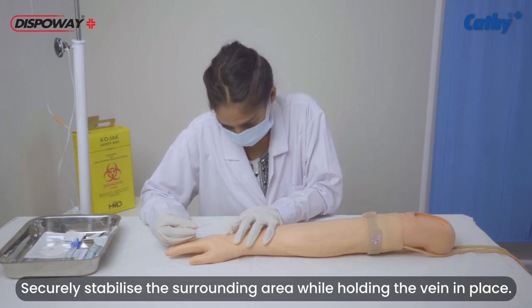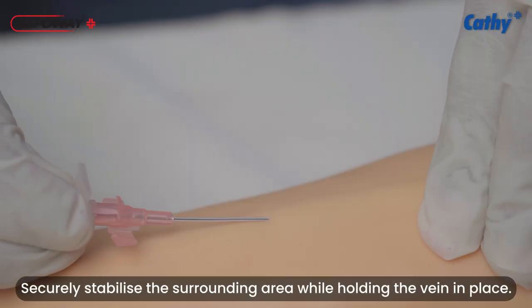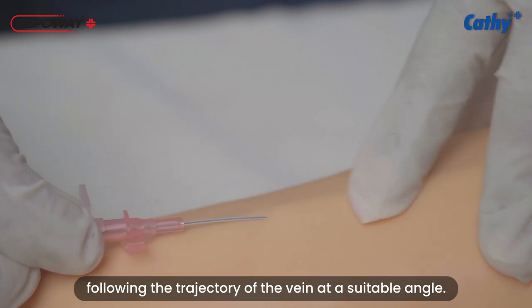Securely stabilize the surrounding area while holding the vein in place, following the trajectory of the vein at a suitable angle.